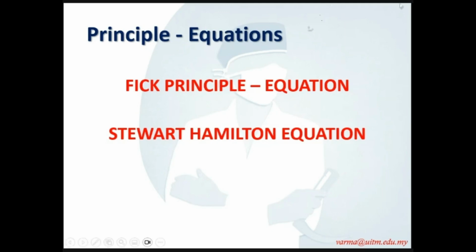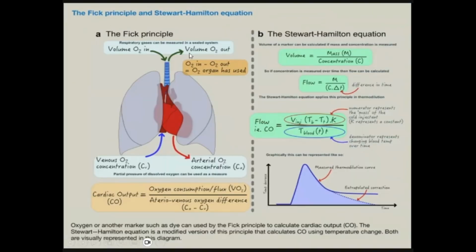So when we talk about the PA catheter, we call it thermodilution. But when we talk about using PiCCO, we call it transpulmonary dilution. I'll come to it later. Okay, so the idea is like this.